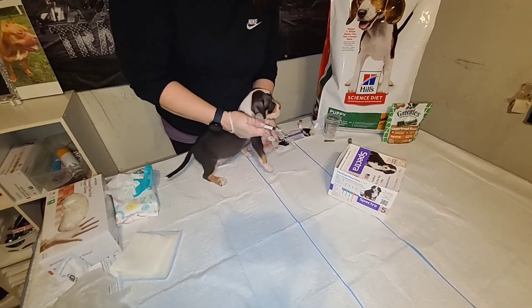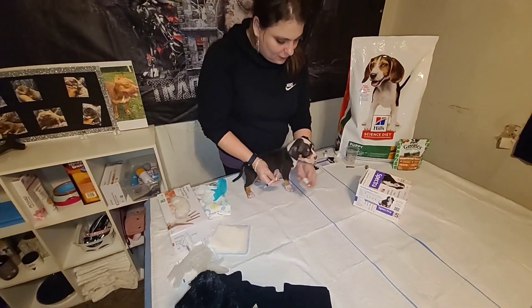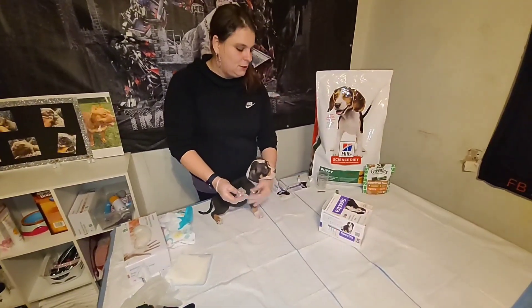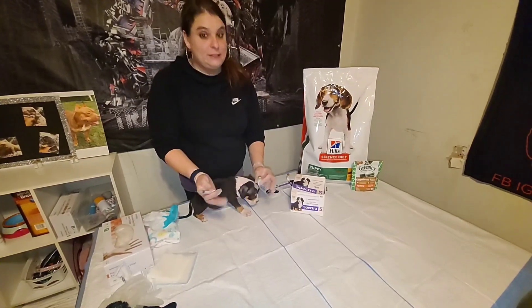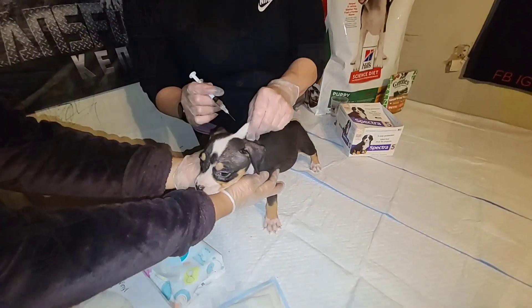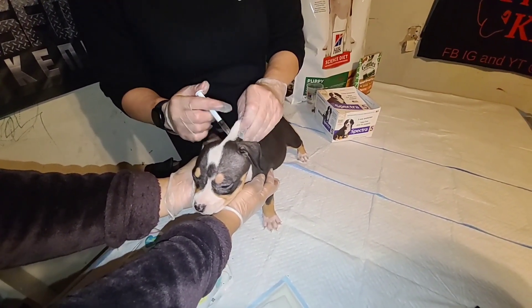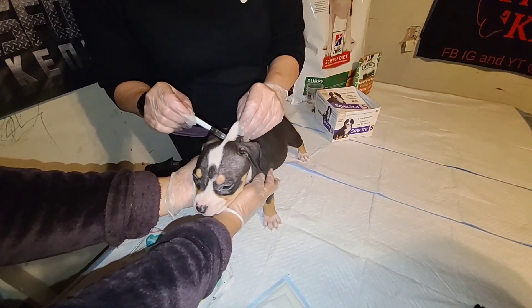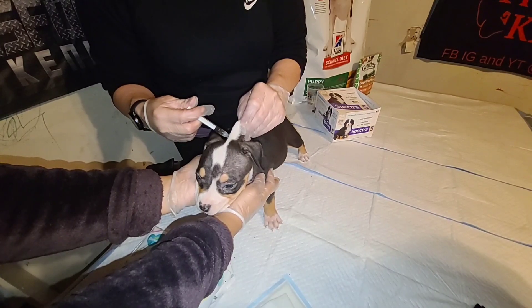Also, before you self-administer vaccines to your puppy, it might be a good idea to talk to your vet about it first. It is very efficient and saves a lot of time and money. Pull back, check for blood — no blood return — go ahead and administer the vaccine.